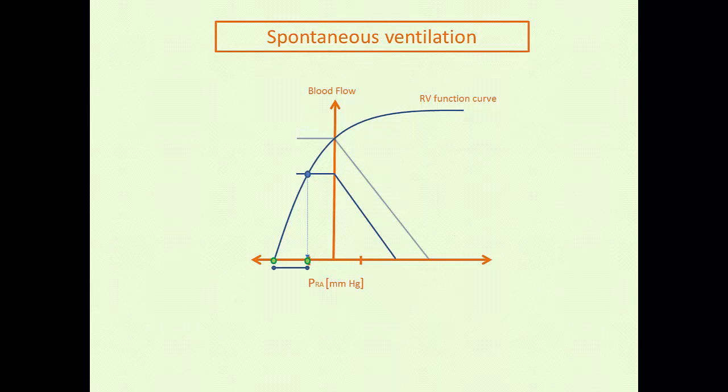So in the following section, we're going to move on to pulse pressure variation in the mechanically ventilated patient with spontaneous efforts. I'm moving on to that section next because now that you've mastered the physiology of the fully adapted patient on the ventilator, and the physiology of the patient who's breathing completely on their own, you can start to appreciate that in a patient who is receiving mechanical breaths, yet is still generating inspiratory and expiratory efforts, pulse pressure variation in terms of D up and D down can be extremely variable and difficult to predict.